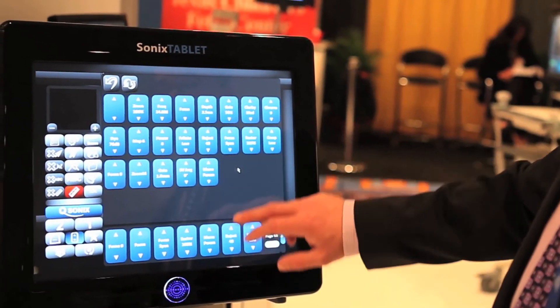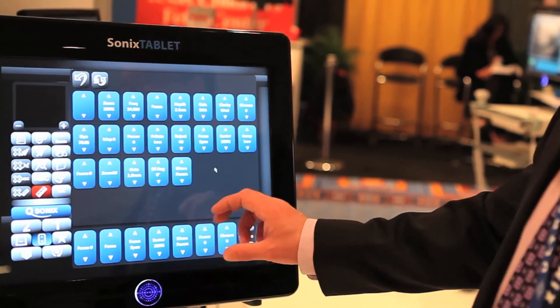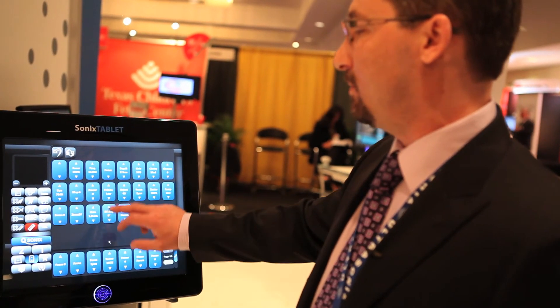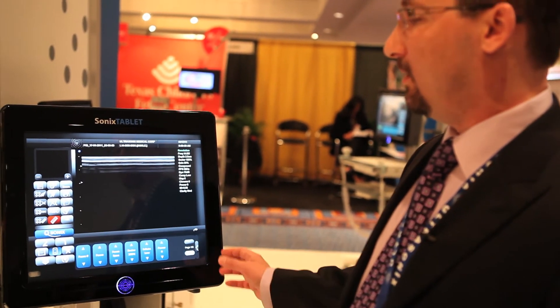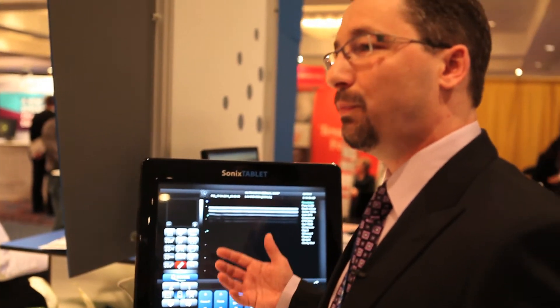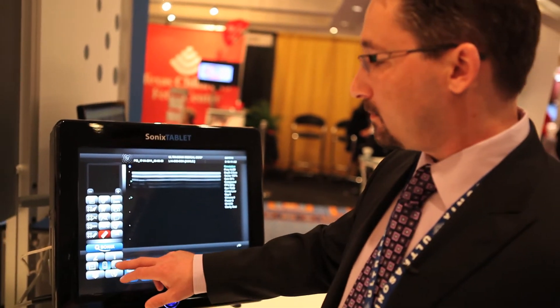If you don't like the buttons currently set up on the screen, you can simply drag them off the menu, grab new buttons, and drag those back down into the lower menu. When you're done with your edits, you simply close the edit screen and you're back into your scanning. You can do it in advance or in real time while performing scans if you need to make adjustments to your menus.